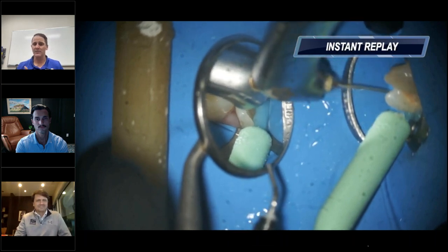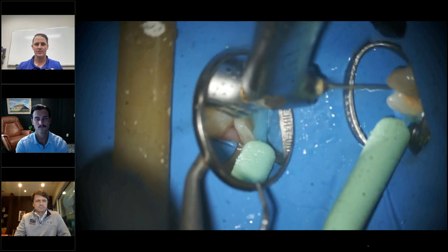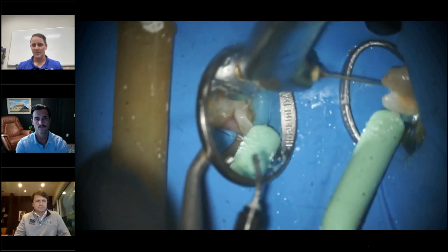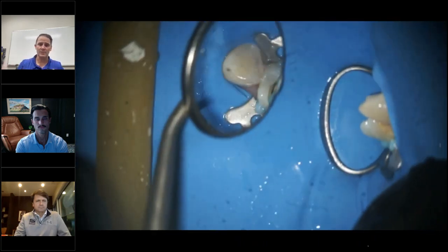Instead of pushing that apically, if you go in with instruments only, we're flushing all that out. And if that's in there, that's clogging up your instruments. So you can see how much easier, with that being out of there, it is to just pass your instrument down and achieve patency. Once you get working length, we all know it's getting from point A to point B. It's pretty simple. So that's the coronal conditioning step there.